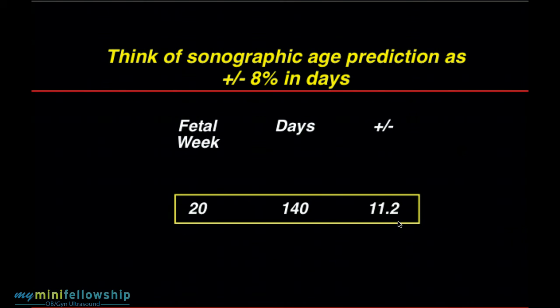So again, between 20 and 24 weeks, I'm very interested in seeing whether size predicted age, age predicted, and dates from the last menstrual period correlate or not. If they do not correlate, I do not draw a conclusion as to why they do not correlate after 20 weeks.